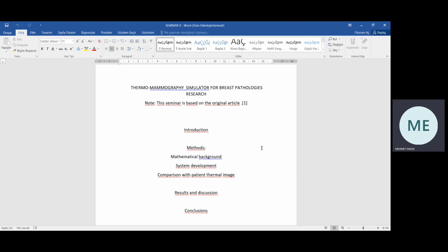That is a procedure used to record body thermal patterns using an infrared or IR camera. The color segmentation of the infrared thermal images is used for detecting the tumor region by different temperature patterns associated with angiogenesis, inflammations, and blood supply increase.